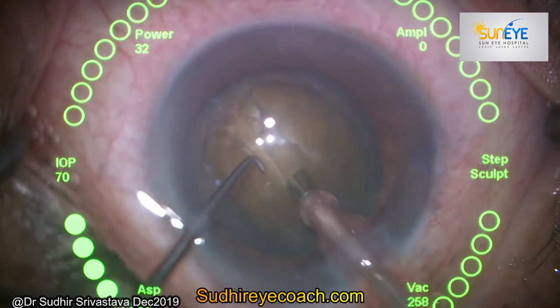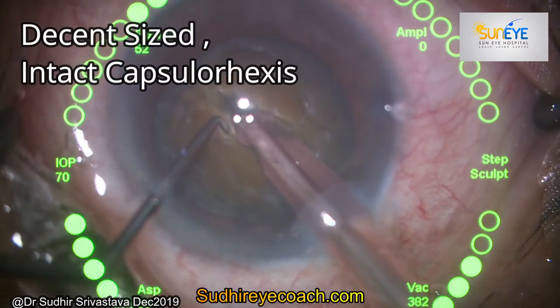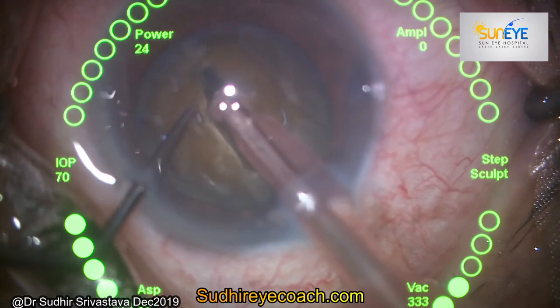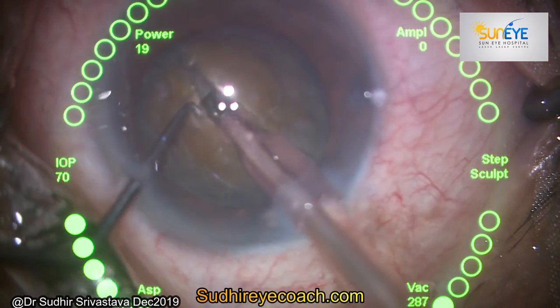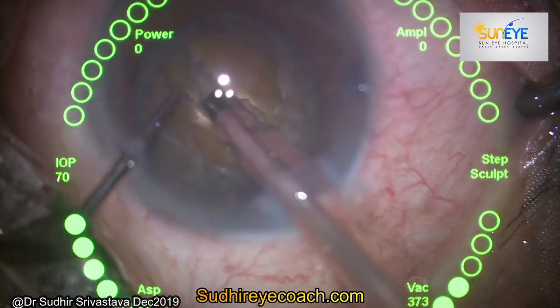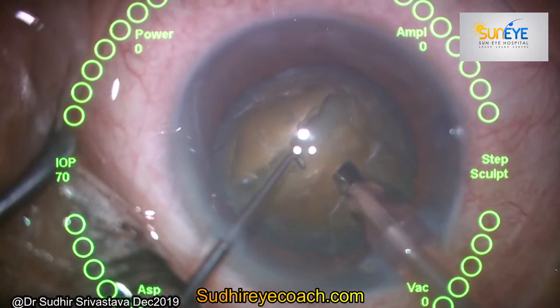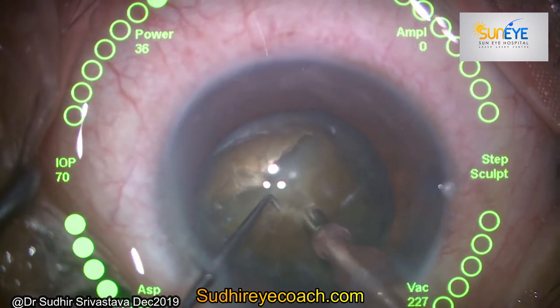The first prerequisite of divide and conquer is to have a decent size intact capsulorhexis. Then start making a trench in the nucleus with moderate power and moderate vacuum. Your trench should be shallower at the periphery and deeper at the center — practically, the trench depth should be almost equal to the thickness of your phaco tip. Rotate the nucleus 90 degrees and again start making a trench to form a plus sign.